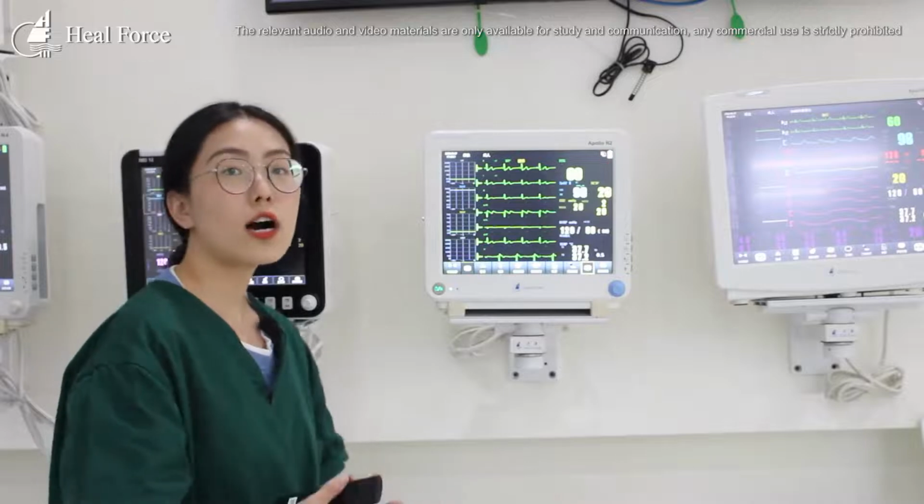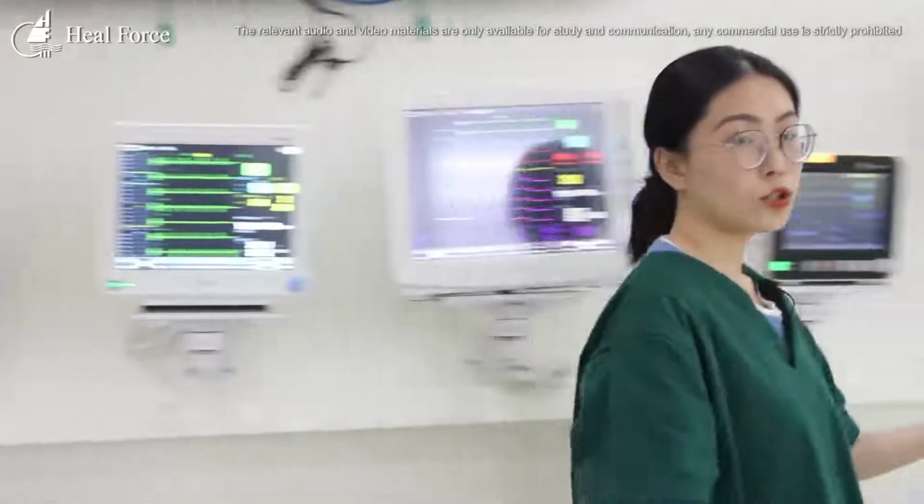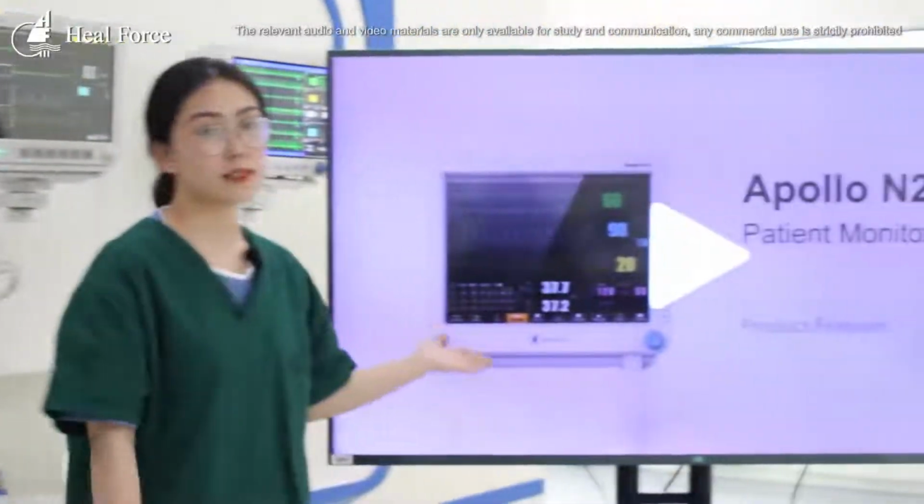So let me show a video to help us better understand the Apollo N2. Let me see it.